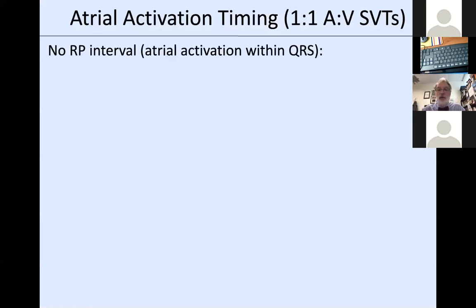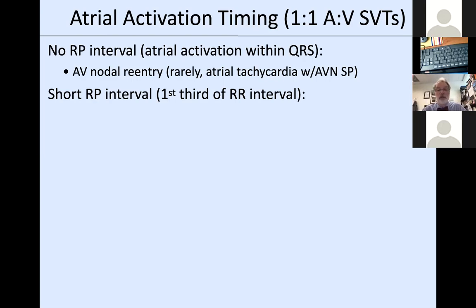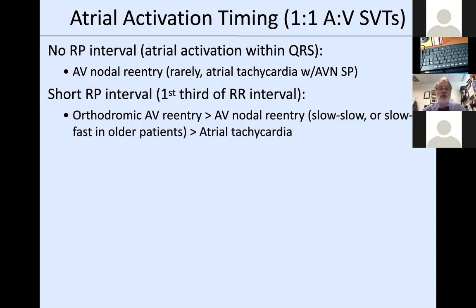Here is a representation of short, medium, and long RP intervals. This really-short example shows the P wave inside the QRS—classically. This is a medium RP and this is a long RP. I show this because these are all different types of AV nodal reentry in one patient. In atrial activation during one-to-one SVTs: if there is no discernible RP interval (atrial activation within the QRS), this is almost always AV nodal reentry.